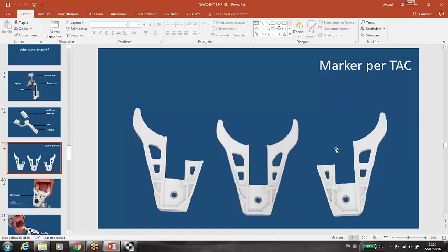So let's say that you are dentulous on the left side, the patient's left side. You would use this fiducial. You will not use this one, because that fiducial is on the right patient side, not the left. Here you will use this if the dentulous part is on the right. If the patient is totally edentulous, you need the two-leg CT marker. You see?